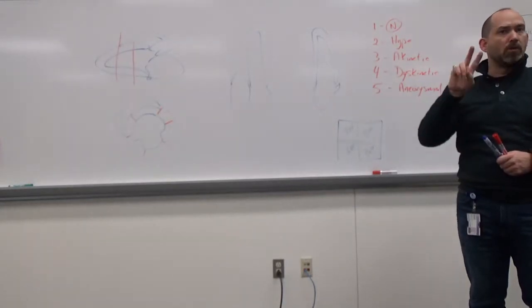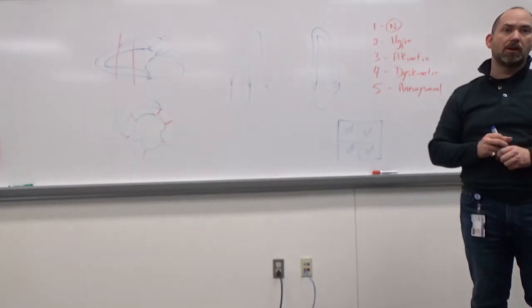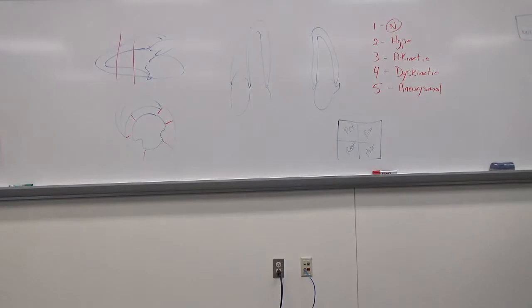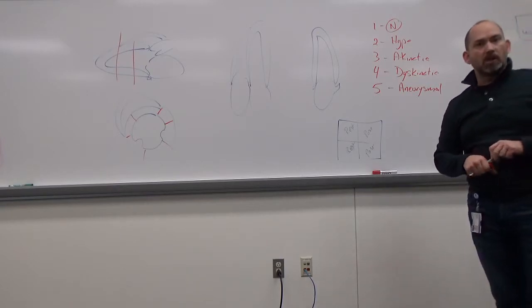But if you're in your normal exercise tolerance range, it's unlikely that those pacemakers are going to be set to defibrillate at that point. You'd hate to be exercising and go, ka-chink. That would not be good. So likely those pacemakers are going to be beyond the range of what we're looking at. Okay? But good question. Those are the types of decisions that will be made by the doctor.